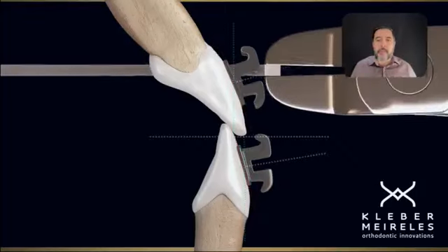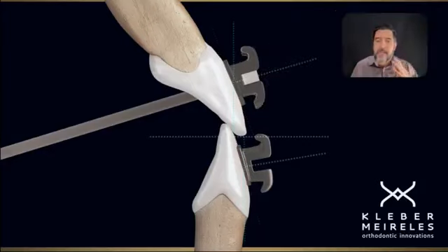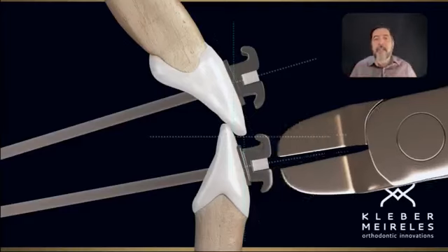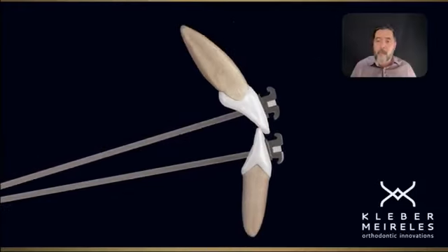And this is what is probably going to happen if you insert a very thick arch wire inside the slot, filling almost completely the slot. You are having this situation. So you reached the rectangular arch wire and then you ruined your treatment because you didn't understand this condition, this combination, and you are going to decompensate your treatment. Is that what you want?